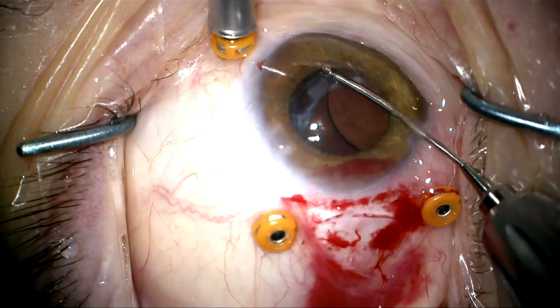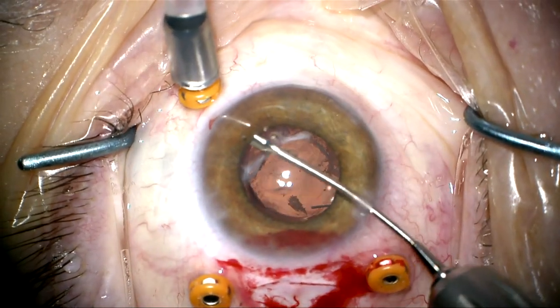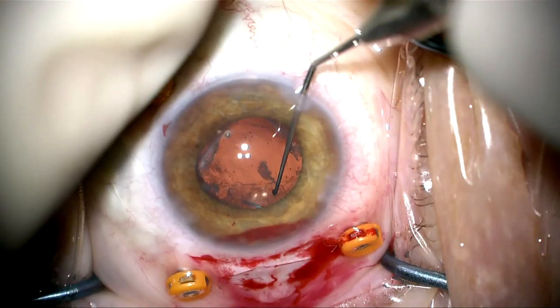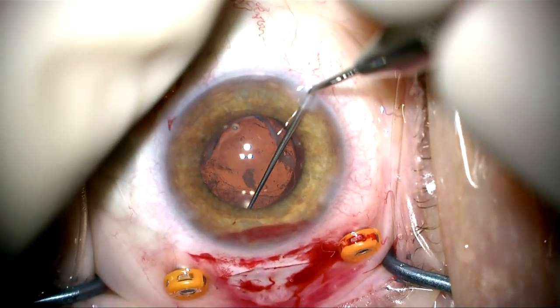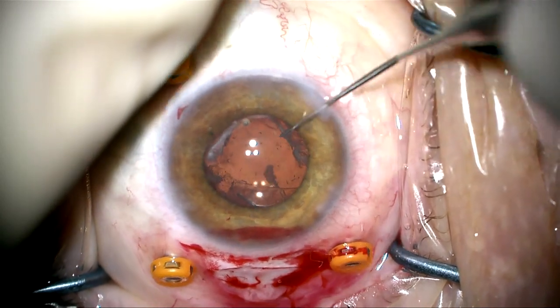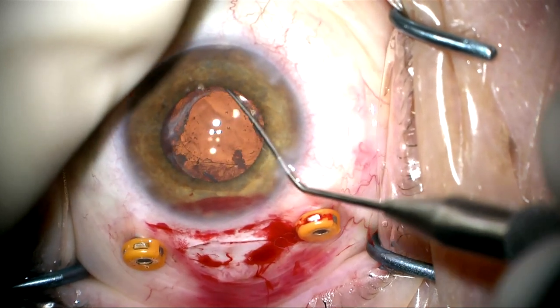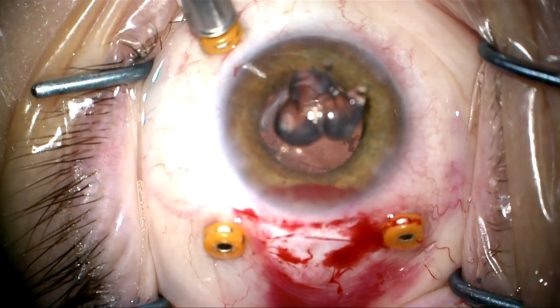I'm watching the other haptic to make sure it stays within the capsular bag fornix. I'm letting go and it appears to be within the capsular bag fornix. I'm going to rotate the lens to make sure it's totally secure. It appears to be very nicely positioned in the same place that the Soemmering's ring had been — in the capsular bag fornix, that donut-shaped segment.